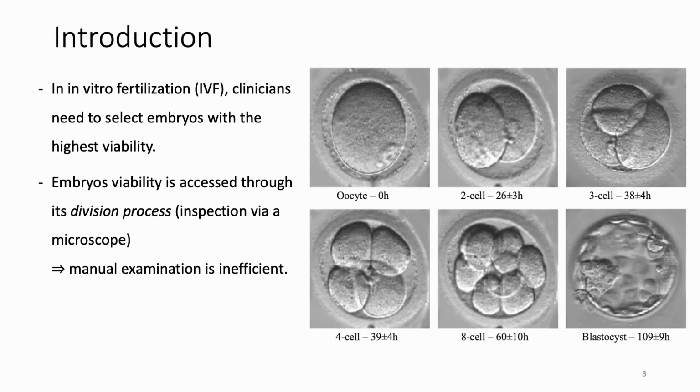During the IVF procedure, a patient is stimulated to produce multiple fertilized embryos. The embryo viability is assessed based on their transition phase between stages of development, which takes several days to finish. Thus, a technique with a microscopic camera captures embryo images at discrete times and creates time-lapse videos that summarize the whole development process. Clinicians have to watch these videos frame by frame and choose the best embryo with the highest probability of pregnancy. This manual job is at high risk of misclassification.